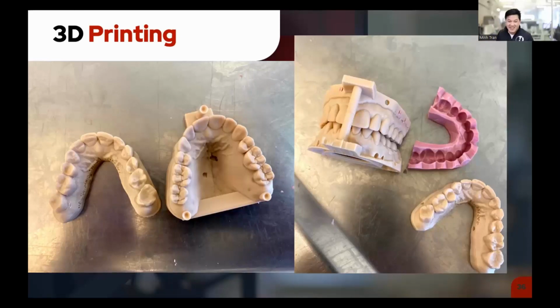I just had a question come through: what printers from Asiga would you recommend using for this? My personal preference, because we do so much dental model, is of course the Pro 4K. If you're just starting out and maybe you're a little bit smaller, I'd say the Max is a little bit more nimble, a little bit more agile in terms of stocking different resins.